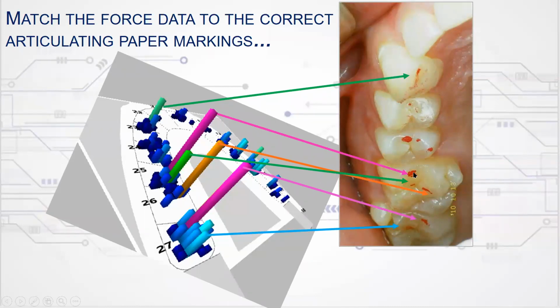Then if we look at the 2-6 mesial, there is a large mark there, which actually corresponds to a very high force. Then if we move a little distal and slightly labial, we have the next contact, which is moderate force. And you see that contact here. And then if we move a little more distal and palatally, we have the next contact, which is this contact on the incline. And that's a fairly high force.